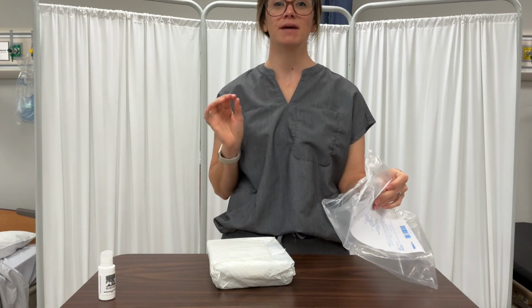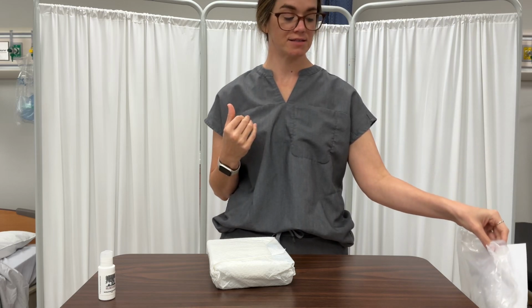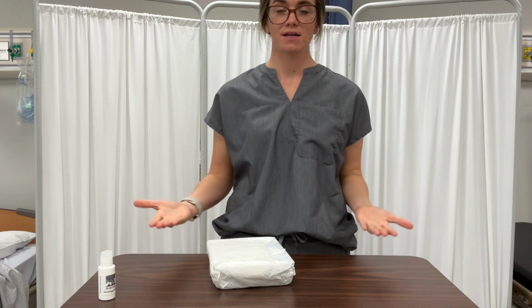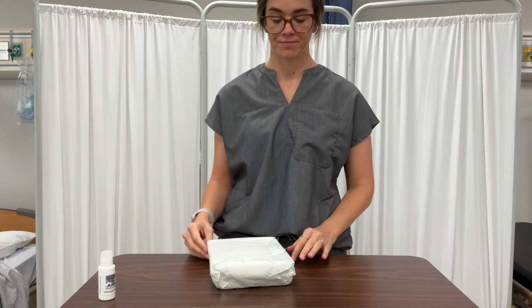I always make my work surface work for me. So I'm going to put a trash can right next to me, okay? So I can just drop it in there. Also, make sure your bedside table is raised to a working height, a comfortable working height.